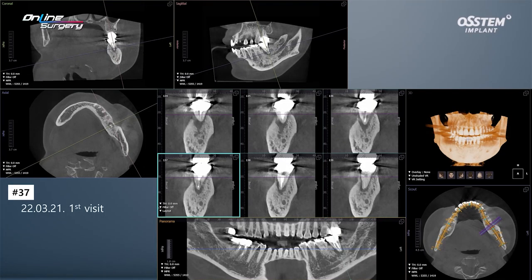As mentioned, there's still a bit of buccal wall left. Rather than using EOS collagen, I decided to use EOS particle to do socket preservation.